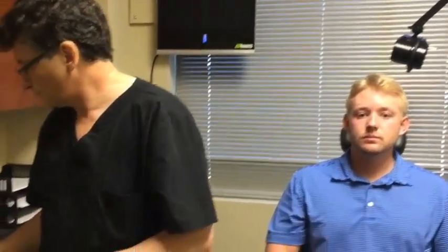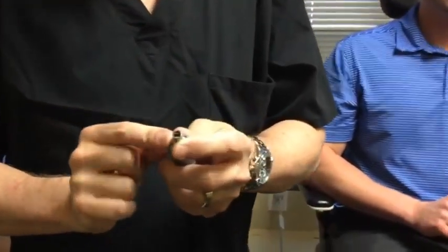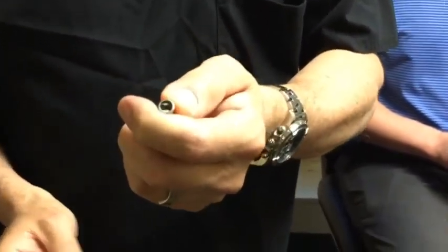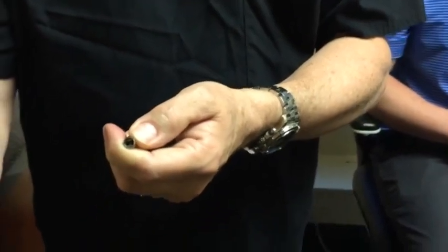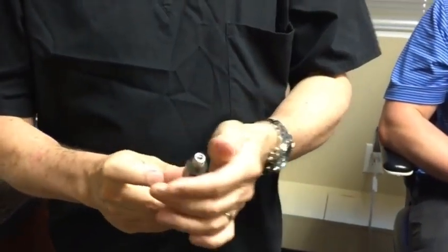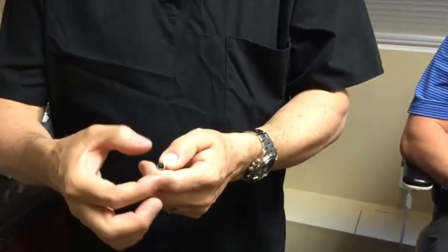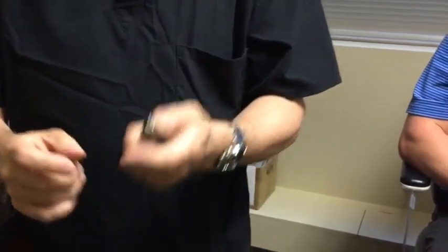The other tip, when you pull out the tip from the chuck, make sure you support the chuck. Grab the tip, support the chuck here before you pull the tip out. That way you're not going to damage this connection between the chuck and the motor. So you hold it in your off hand, use your dominant hand, take the tip, and remove the tip while you support the chuck. And again, do not forget to rinse your patients at the end.